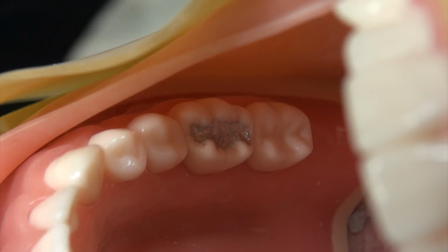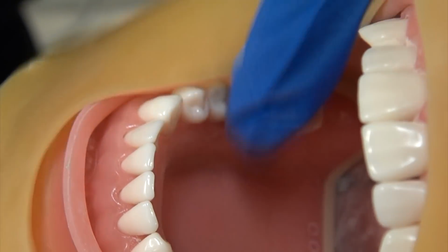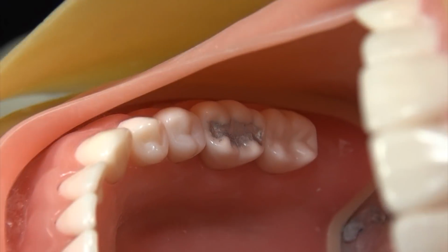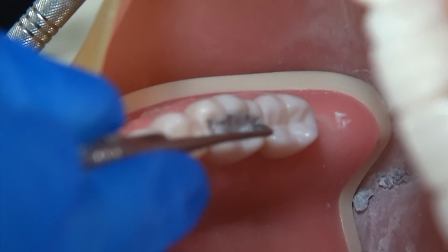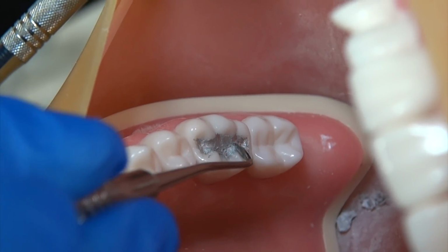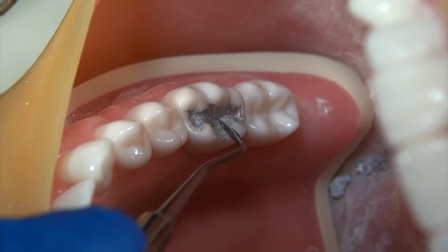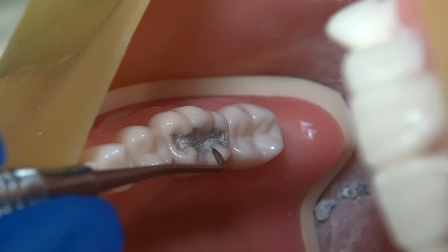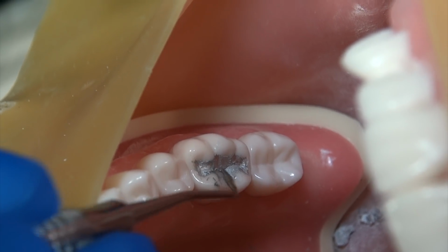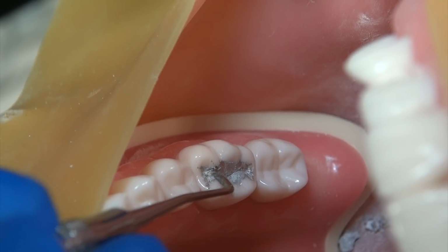Now, two other nice instruments to use are the half Hollenbach as well as the discoid. Look at those tips. Those are really going to help you create nice, clean finishes as well. So real important, I'm showing you several instruments because you really want to know how to use every instrument in your armamentarium. See how with this, you can go down nice slopes. And for this, as I'm scraping across, I'm putting pressure only on the tooth structure. So no pressure on the amalgam at all. Trying to get off that flash so I don't get easy points lost.